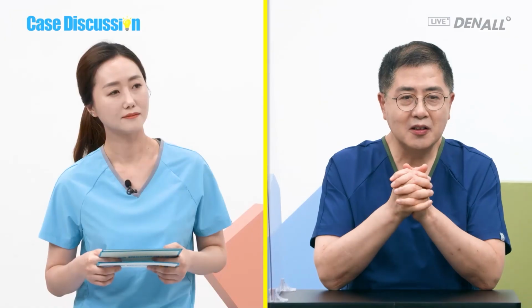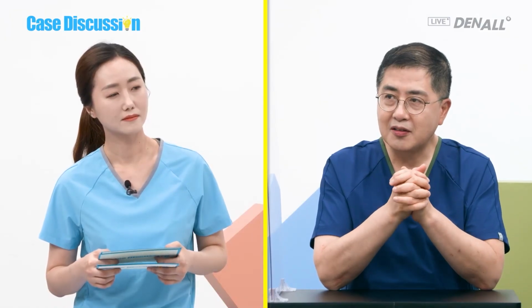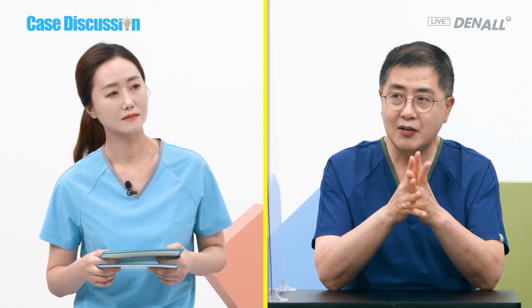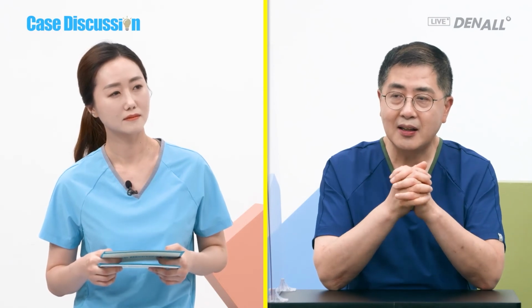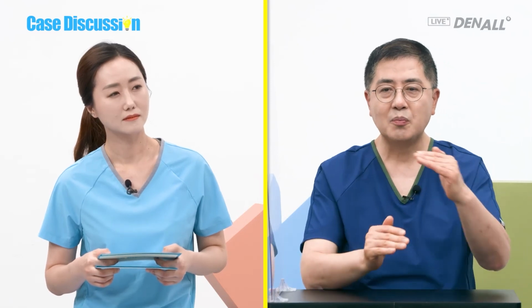Time is critical. The problem is, if we can shorten the time, it will be good to increase the patient satisfaction. I measure ISQ to determine the timing. If we determine the bone quality just based on photo or panorama X-ray, it is not easy.